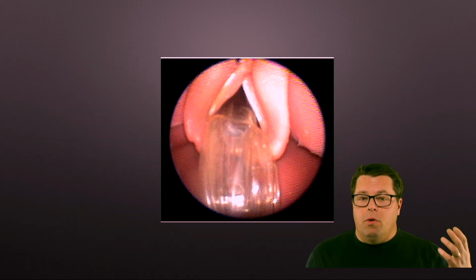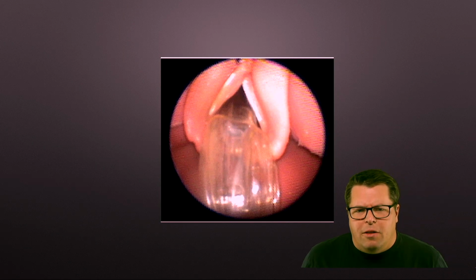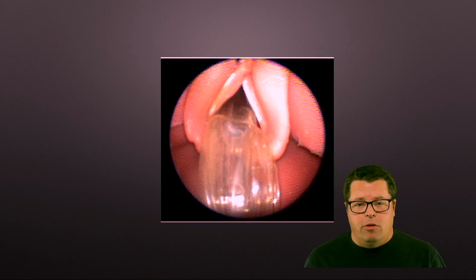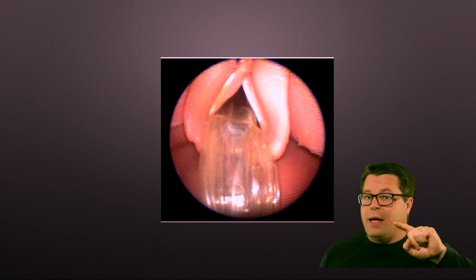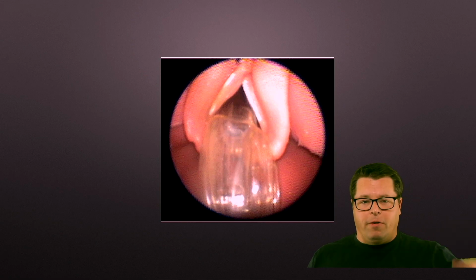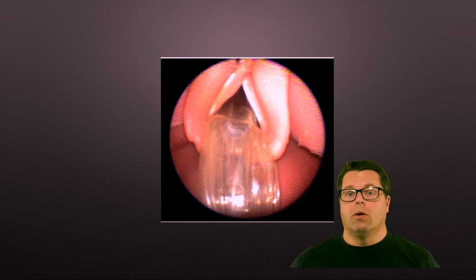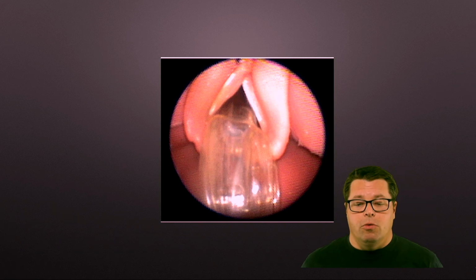How many times have you moved a patient and you thought, nothing's changed, and the tube has slid out or moved a little bit, or maybe it was just kind of hanging in there right in the first place? Because this guy will give you, yes, a good End Tidal CO2 signal, and you'll say, well, that tube's not in the right spot. The tube is in the right spot-ish in that it's allowing gas to pass, but if you move a little bit and it falls out, well, it'd be good to know about that, because you saw that tube go through the cords. Did it stay in the cords? And that's one of the critical things that we are proving with End Tidal CO2 measurement.